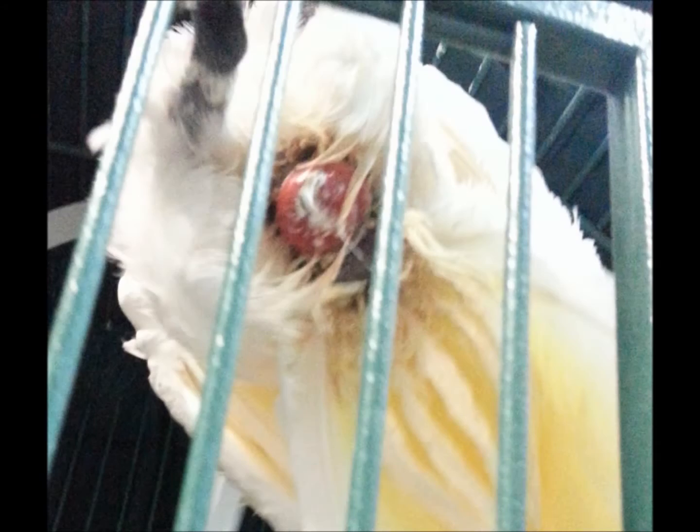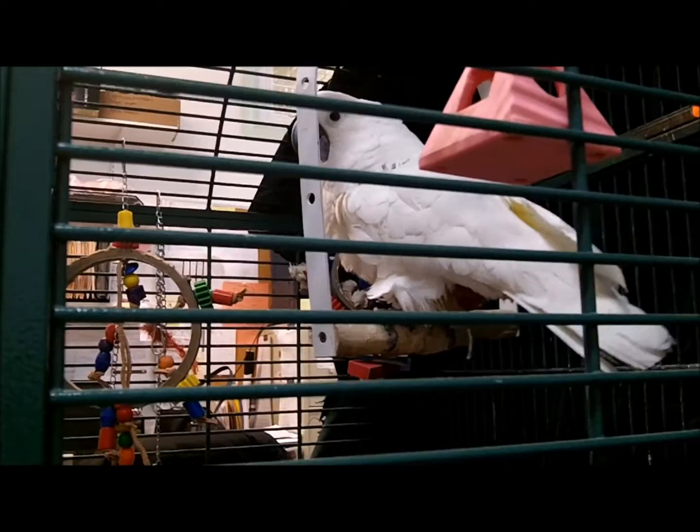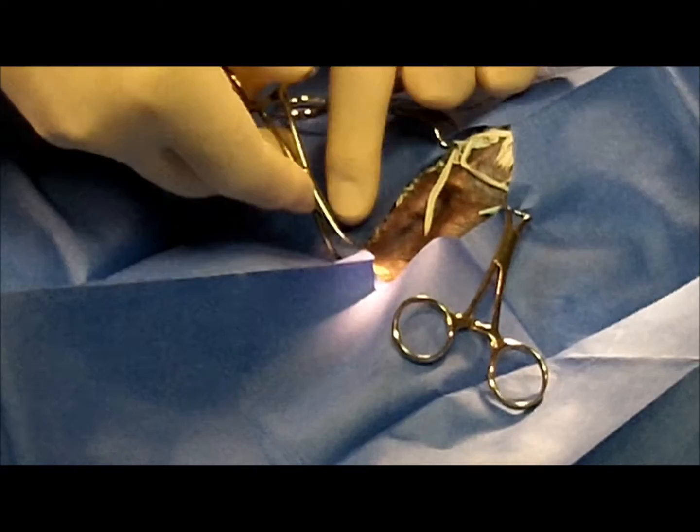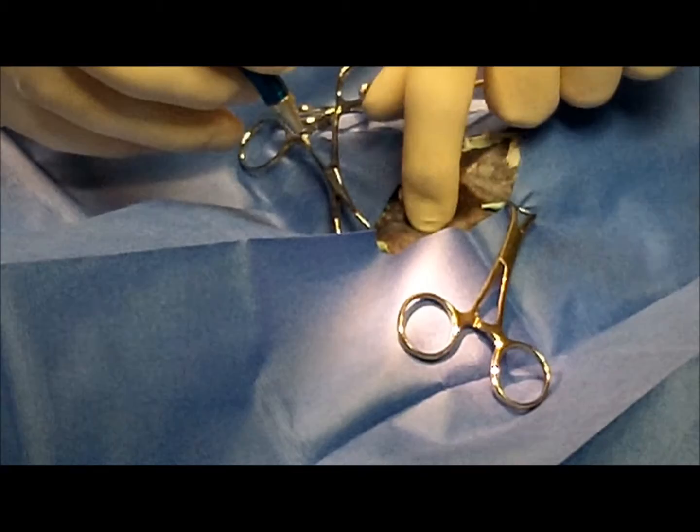We're going to look at this cloacopexy of baby bird, who is a cockatoo. There's a picture of the prolapsed cloaca, and there's baby bird — you can see her sitting on the cage, she's in pain and not able to defecate properly. Here we have her positioned on the surgical table, and we're draping her in. Sometimes the drapes that work better for this are ones that adhere to the skin.